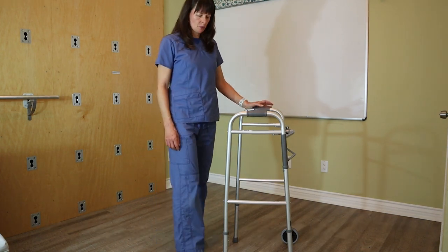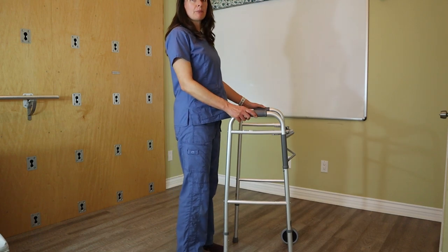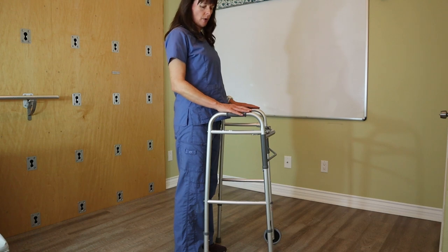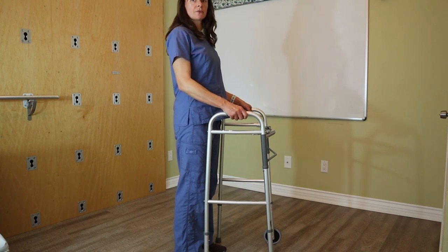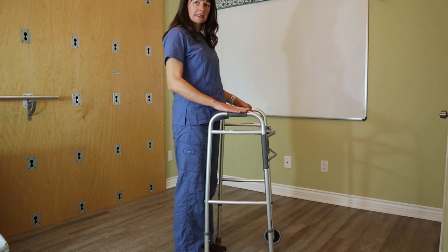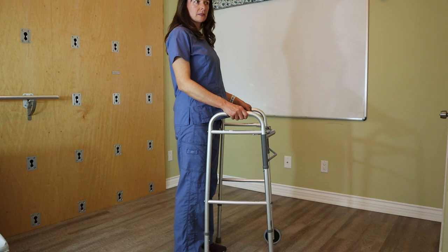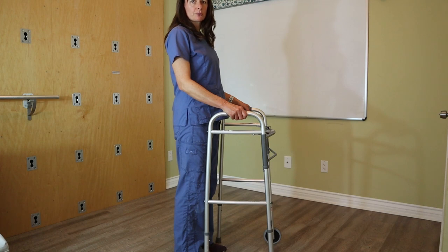We want to make sure that the patient stands upright in front of the walker and that the height is adjusted so that the patient can comfortably grasp the walker at the top. The height of the walker should be about their hip joint, and the hands or elbows are just slightly flexed so the patient can support themselves properly.